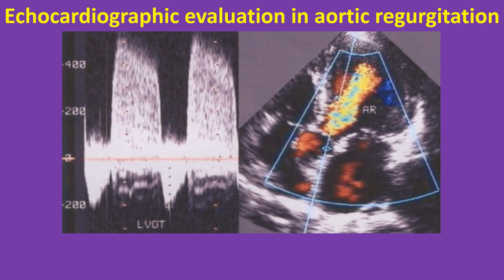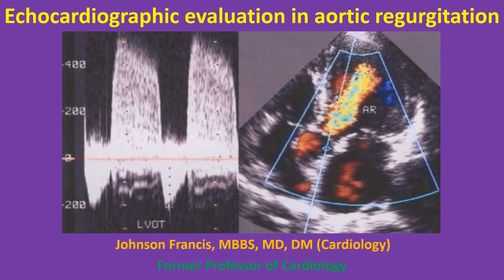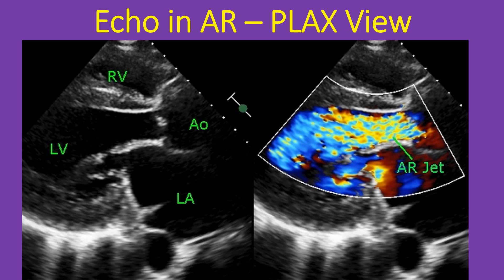Echocardiographic evaluation of aortic regurgitation demonstrated through multiple images. The echocardiogram in parasternal long axis view shows a dilated left ventricle, left atrium, aorta, and a small portion of the right ventricle, which is usually the outflow region.